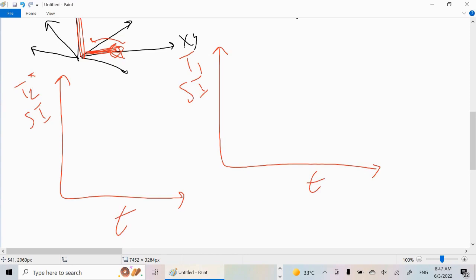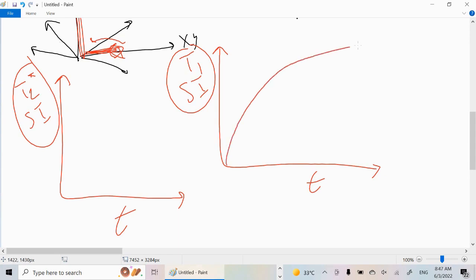What will happen to the signal intensity for T1, and what will happen to the signal intensity for T2? If I am discussing T1 for a specific tissue without any contrast, its recovery will be different. After applying the contrast agent, its recovery will be faster.